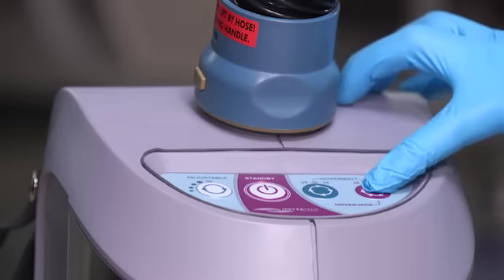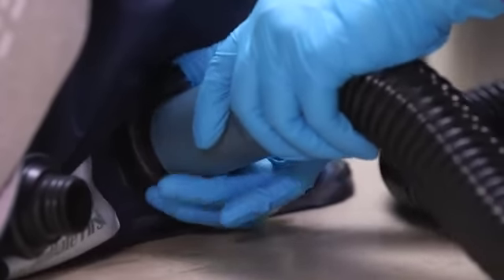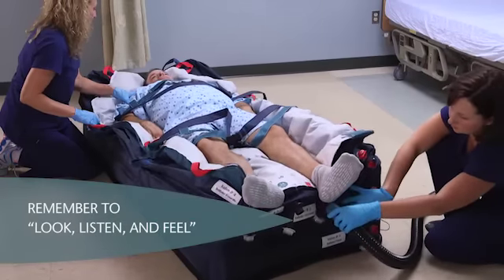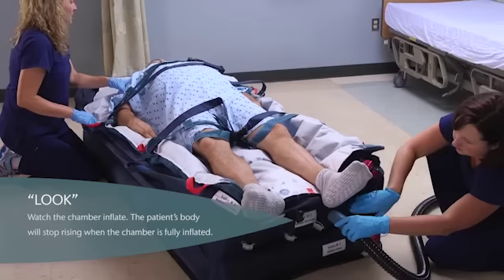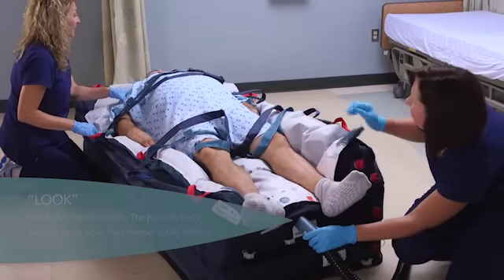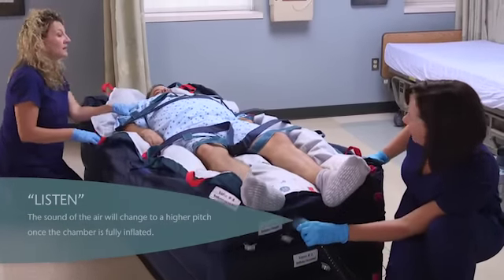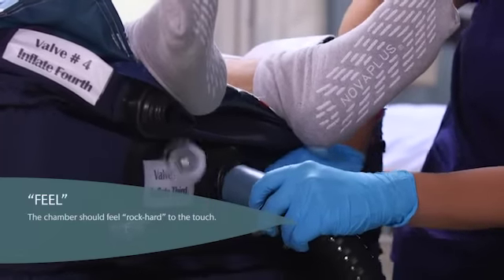Press the HoverJack button on the air supply to initiate airflow and begin inflation. To ensure that each HoverJack air chamber is fully inflated, remember to look, listen, and feel. Look: watch the chamber inflate. The patient's body will stop rising when the chamber is fully inflated. Listen: the sound of the air will change to a higher pitch once the chamber is fully inflated. Feel: the chamber should feel rock hard to the touch.